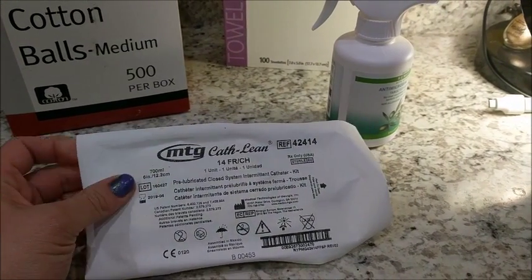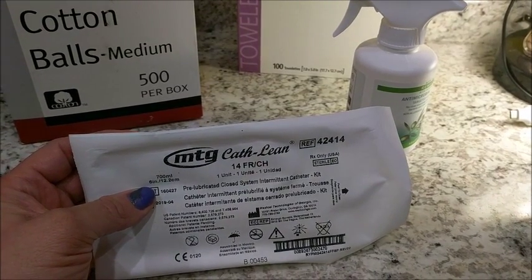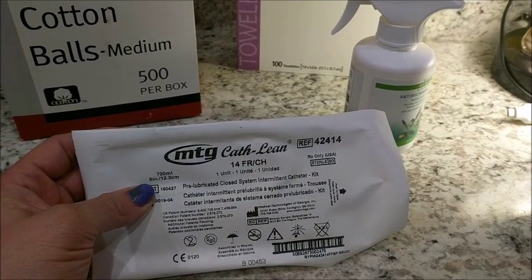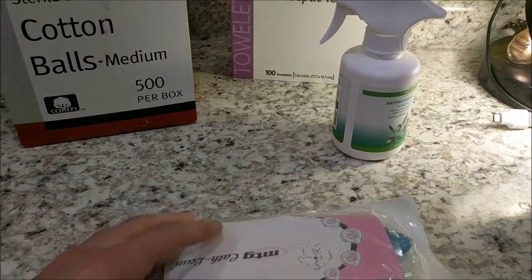They make these also for males. These are specifically for females. They make them for males and they have a completely different name, but they do make the same idea for the guys too.